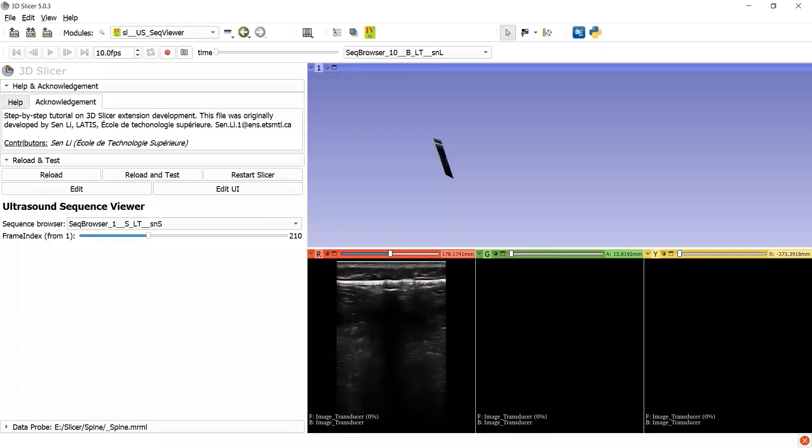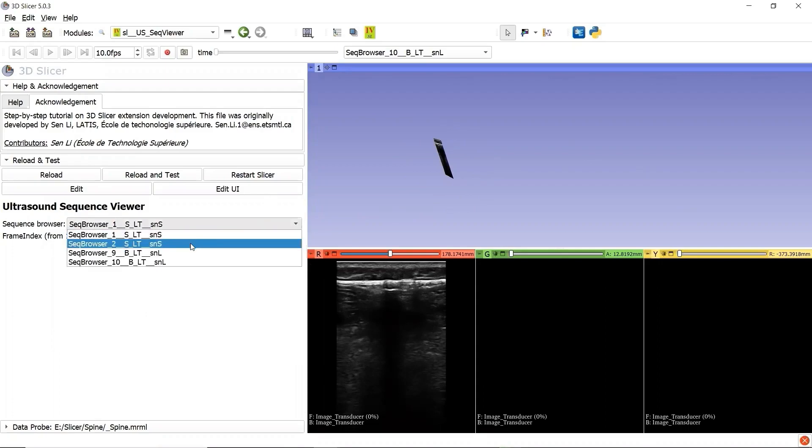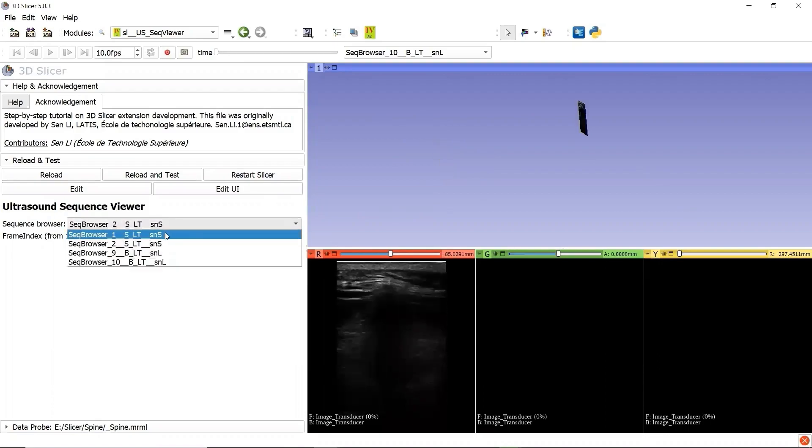Let's go back to the 3D slicer and compare our custom module Ultrasound Sequence Viewer with the Sequence Viewer in the existing module Sequences from 3D slicer. Let's pay attention to the ultrasound image in both 2D widget red and the 3D widget. See the difference when we change the active SequenceBrowser node from the drop-down list in our module. We can observe the change of the active ultrasound image.